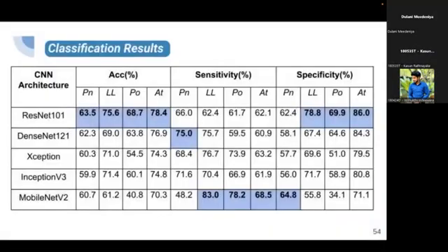So these are the results of the initial comparative analysis that we have done using different CNNs for visual feature extraction. This was the first attempt to improve the encoder. According to that, as you can see, the ResNet has better values compared to the other models.